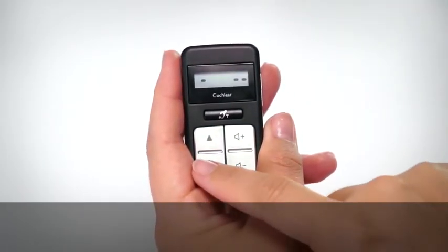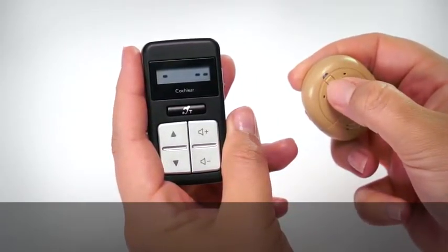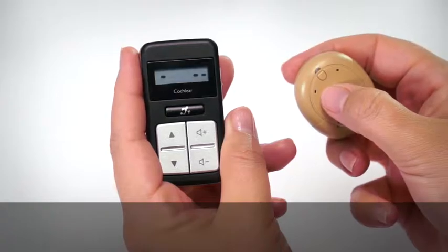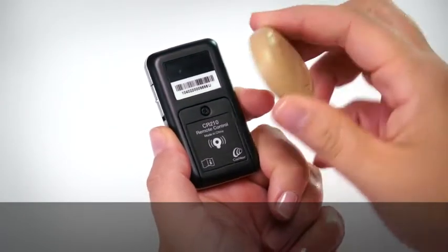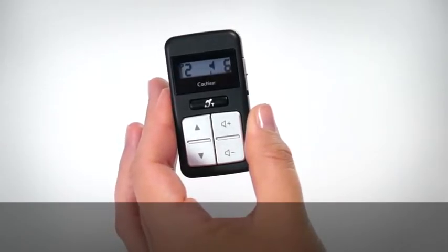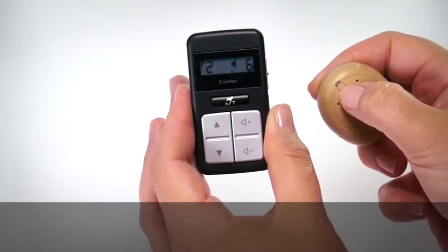Turn on your remote control. If your remote control is not paired to any processor, it displays dashes and blinks when you press buttons. Turn on your Kanso in order to pair it with your remote control. They must both be awake and on while pairing.